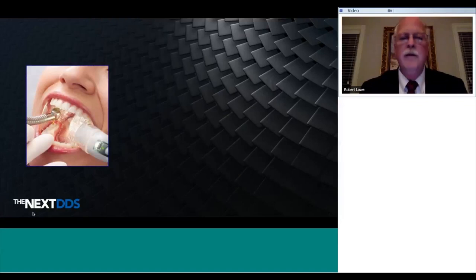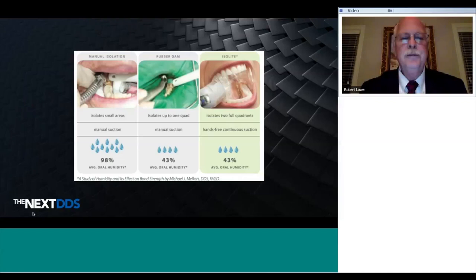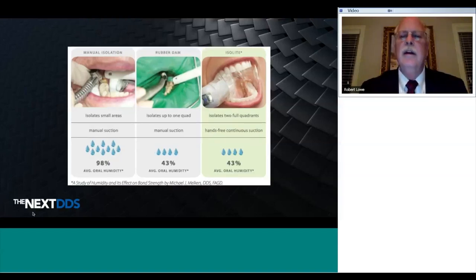There have been forms of isolation that have been developed that are of use in clinical practice. One of these is what you see here pictured, an Isolite. An Isolite is a combined bite block, illumination device, and isolation device that within a couple of seconds can be placed and isolate an upper and lower quadrant and allow you to do your preparation. It also helps occlude the airway, so it protects the airway when you're removing restorations such as amalgam, gold, or crowns. When you're doing bonding procedures, it keeps the saliva and the tongue out of the way to keep moisture at bay so that you can do an adhesive procedure successfully, fully cure and finish. Studies have shown that these types of isolation techniques do as good a job as our traditional isolation with rubber dam as far as oral humidity and moisture control.